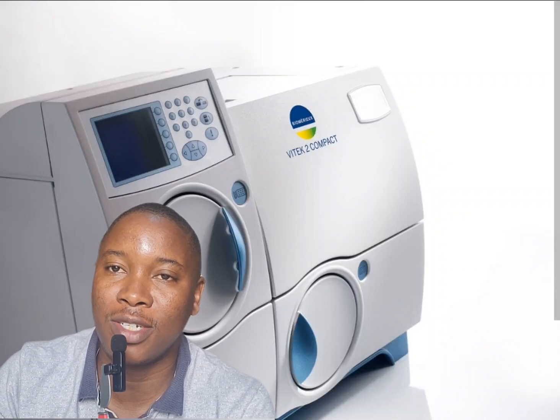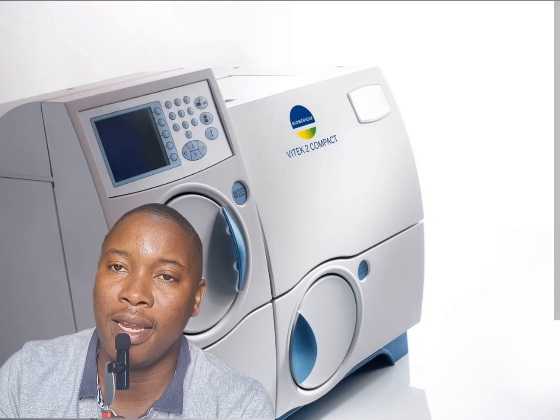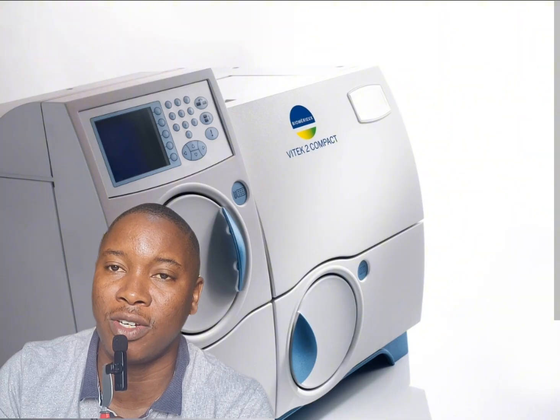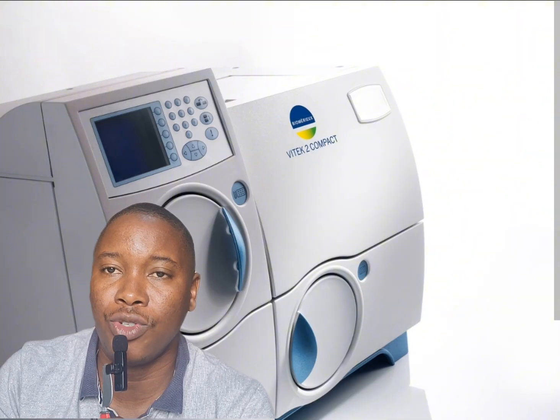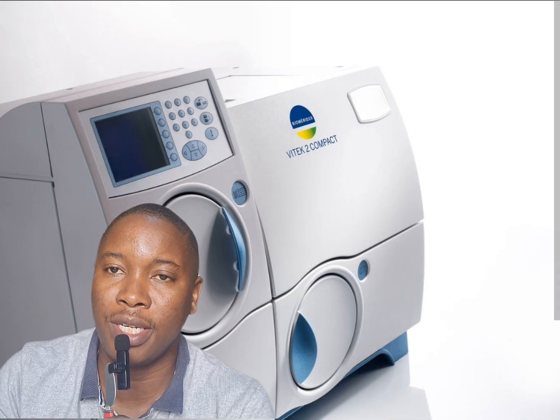Today we are going to be discussing the use of what we call the Vitek 2 system. Now, the Vitek 2 system is an automated system for identification of microorganisms. Now, usually when we want to identify microorganisms, we do so by culturing them in the laboratory.